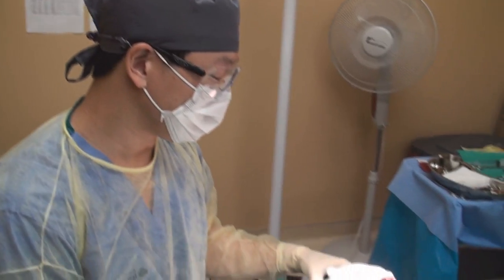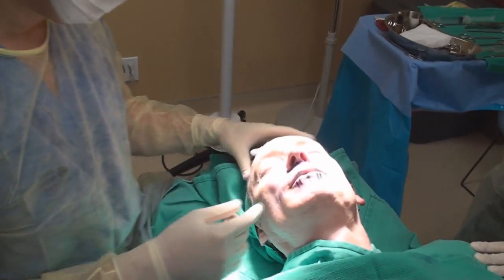Hi, we're doing some lip augmentation today, and we're doing a combination of procedures including a lip lift in the upper lip area as well as lip advancements, V-Y advancements in the lower lips. I just wanted to show you kind of what we're planning.